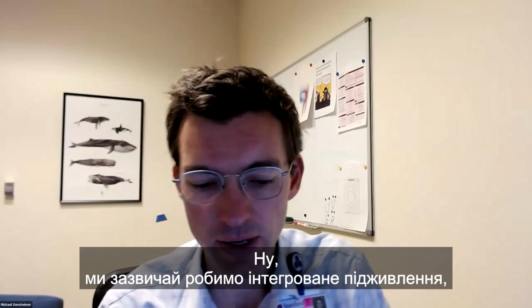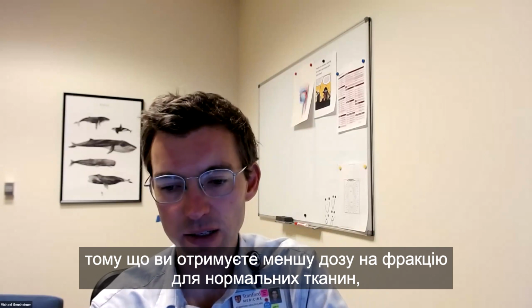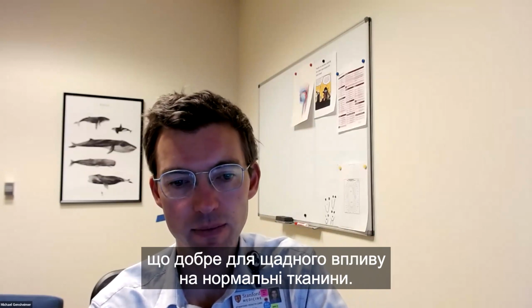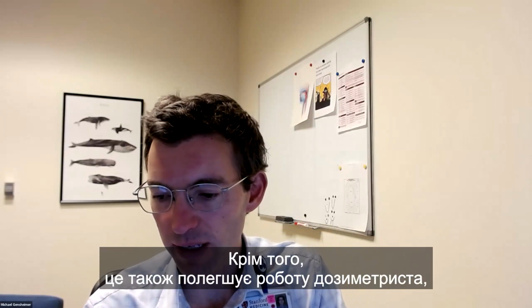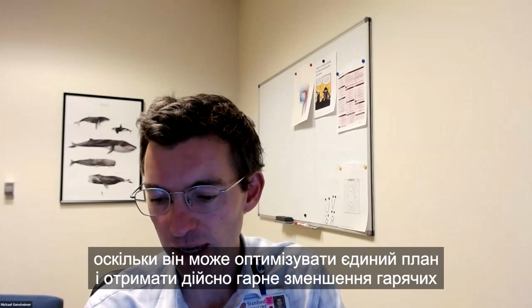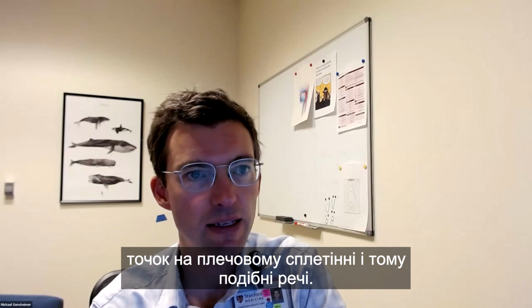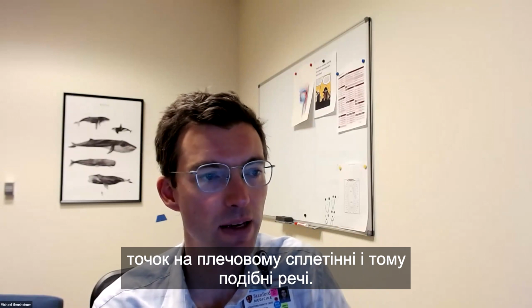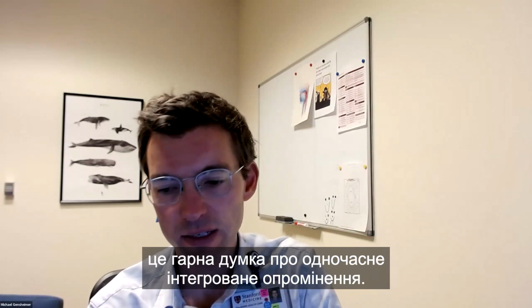Yeah, that's a good point. Well, we typically do integrated boost because you get lower dose per fraction to the normal tissues, which is nice for the normal tissue sparing. And it also just makes it easier for the dosimetrist, since they can optimize a single plan and get really nice reduction of hotspots on the brachial plexus and this sort of thing. In terms of the weight loss, yeah, that's a good point about the simultaneous integrated boost.